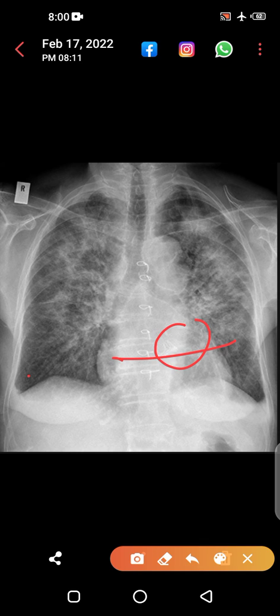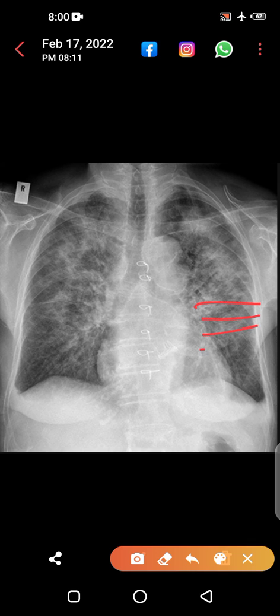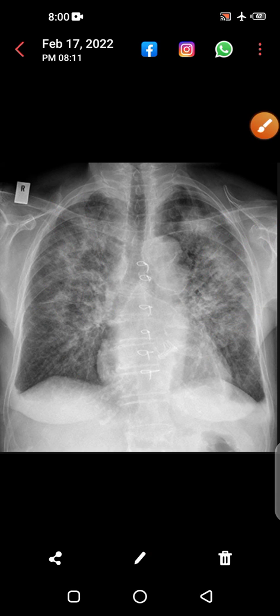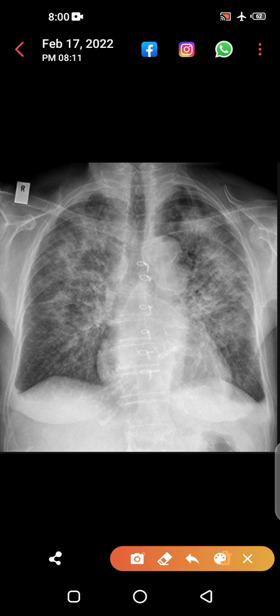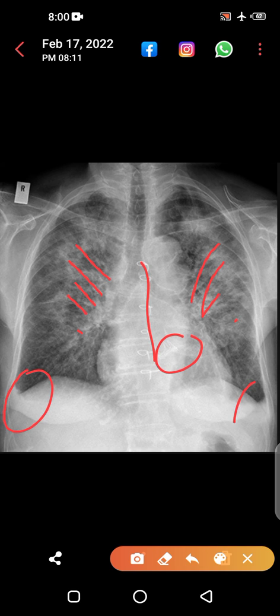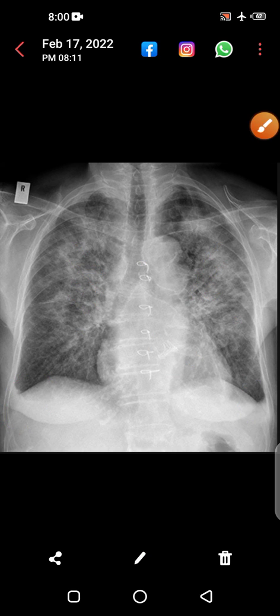There is blunting of the costophrenic angle, reticulations, and upper lobe diversion — normally vessels do not go towards the upper lobes; this is called upper lobe diversion. This is a CCF — this is a classic X-ray of congestive cardiac failure. You should not miss these findings: sternotomy wires, the metallic valve, reticulations, and bilateral blunting of the costophrenic angles.